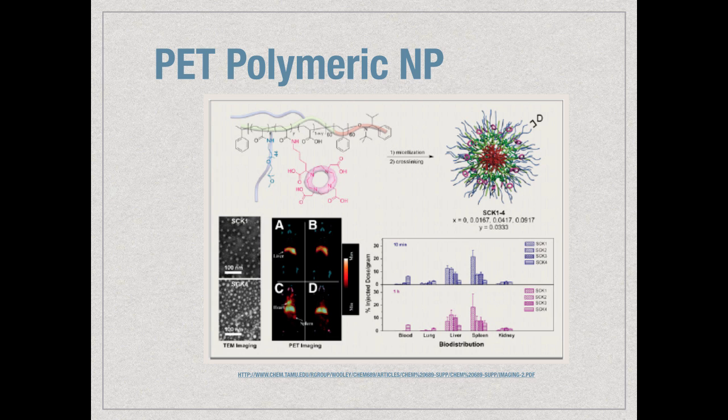Now, the reason why I say that is because we're tracking the radiotracer, and so if the radiotracer is cleaved in the bloodstream or anywhere else and is released from the nanoparticle, then you're no longer tracking the nanoparticle, you're only tracking the radionuclide. So a lot of studies have to be done ahead of time to see what that cleavage rate is in serum or plasma or whatever, so you can figure out how intact or how stable the nanoparticle complex is. But it's a pretty decent approximation.